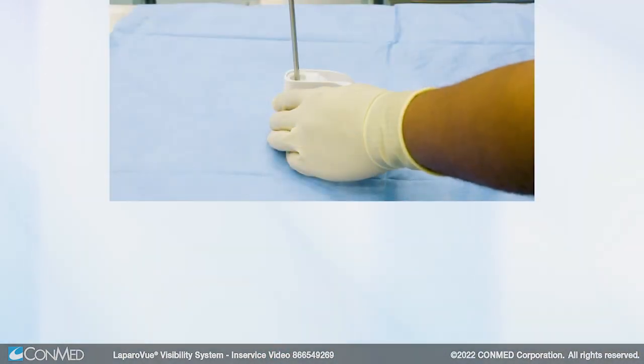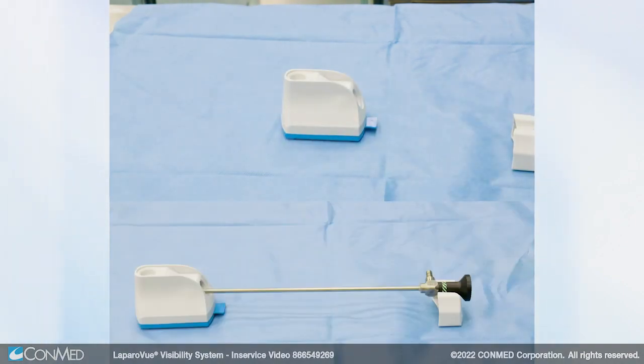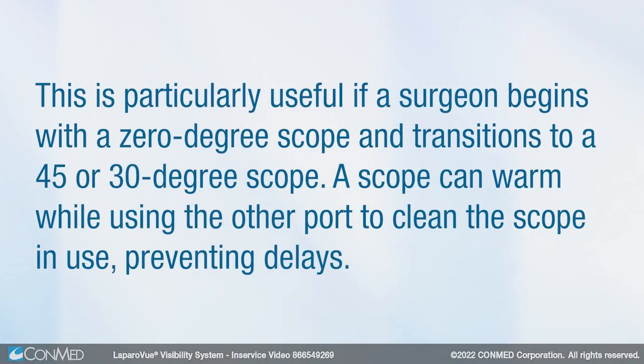Both the vertical and horizontal ports can be used at the same time. This is particularly useful if a surgeon begins with a zero-degree scope and transitions to a 45 or 30-degree scope. A scope can warm while using the other port to clean the scope in use, preventing delays.